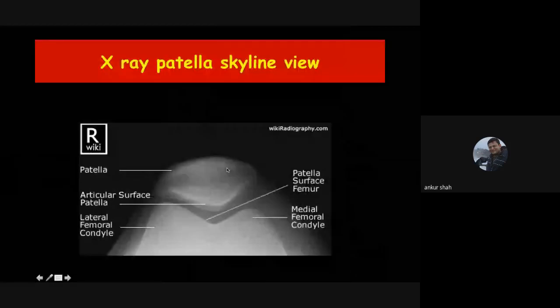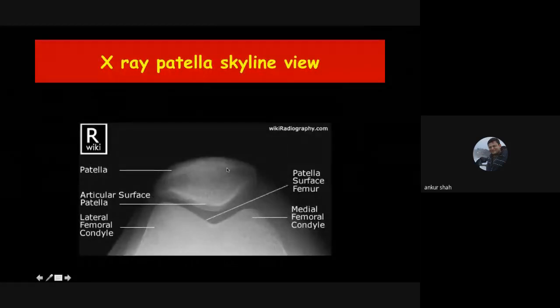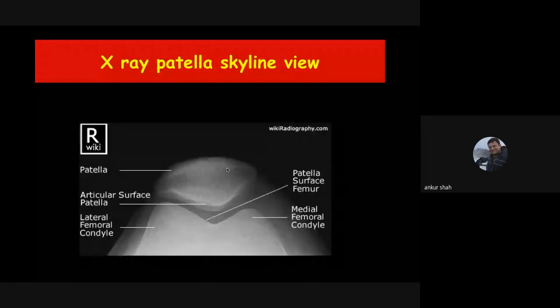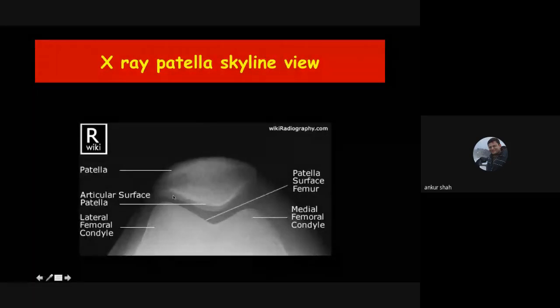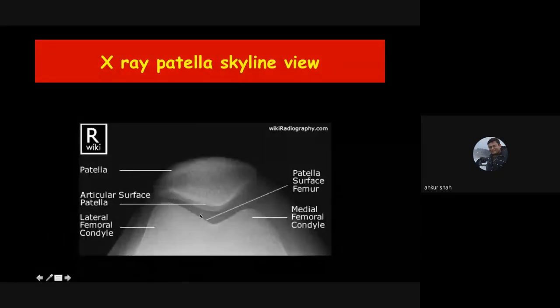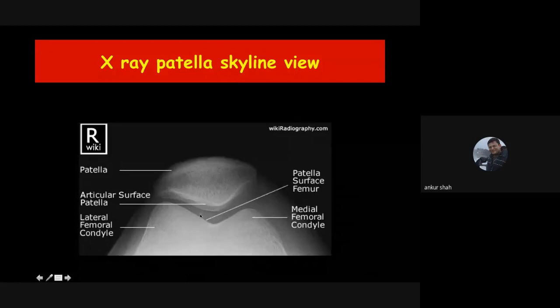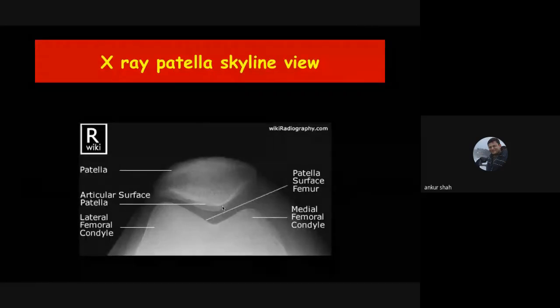One more important view for the knee joint is the skyline view of the patella, where you can see the patellofemoral articulation very nicely. If there is any patellofemoral arthritis or an osteophyte, you can see it very nicely on this view. These are the main three views used for knee joint radiography.